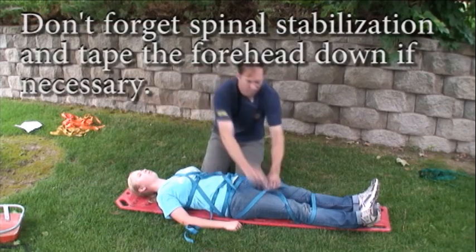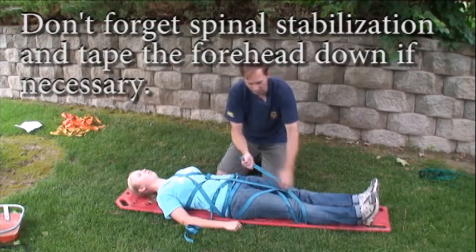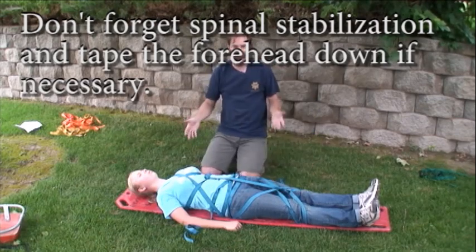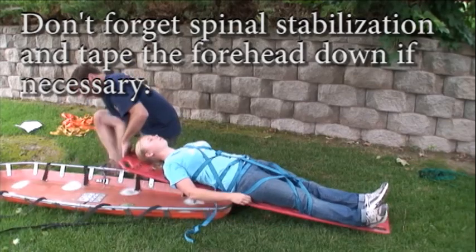You will want the arms secured inside the litter to prevent injury to them, but you don't need to do that at this point. Leave it loose for now — when we do our lashing, we'll secure those down.